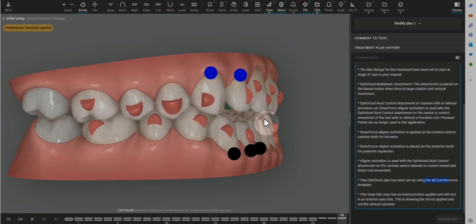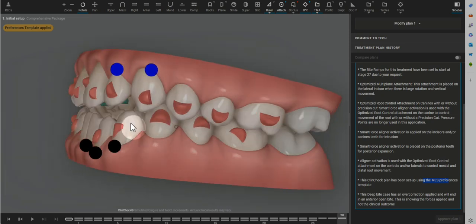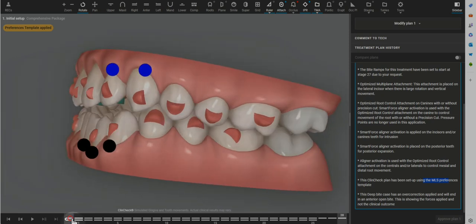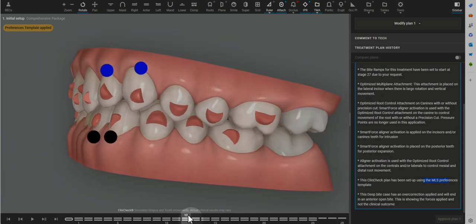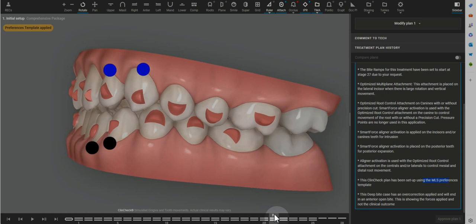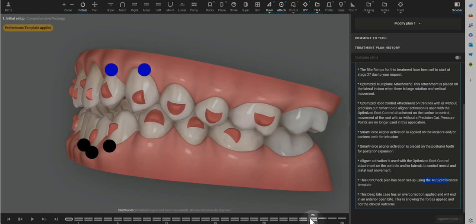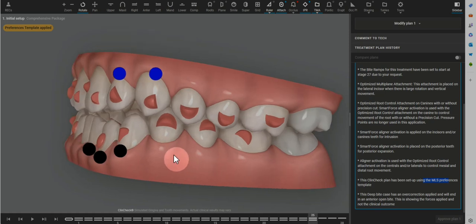Such as the exaggeration or over-treatment of anterior intrusion to resolve a deep bite. We know that intrusion doesn't happen 100% clinically, so doing more and more or creating aligners that do more and more really is helpful there.